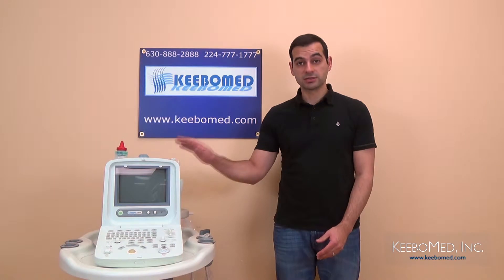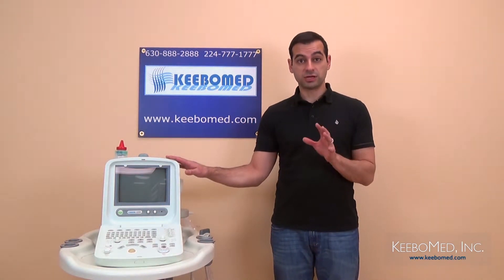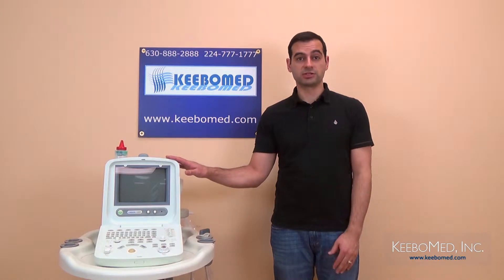Hi, I'm Timothy from KiboMed, and this is the Chison 8300 Human Ultrasound. In this introductory video, we're going to consider some of the features and advantages of this system.